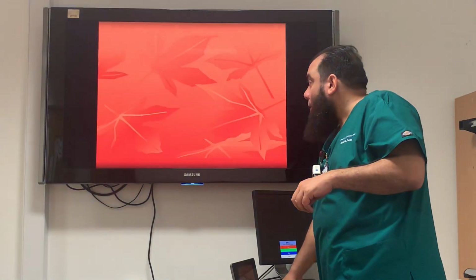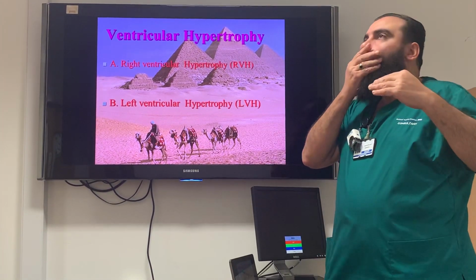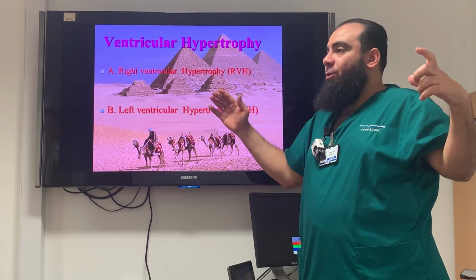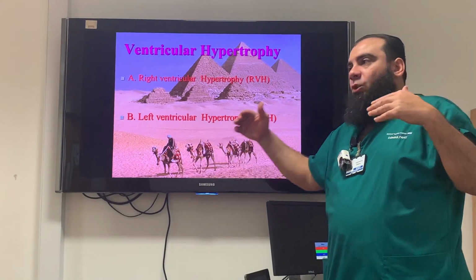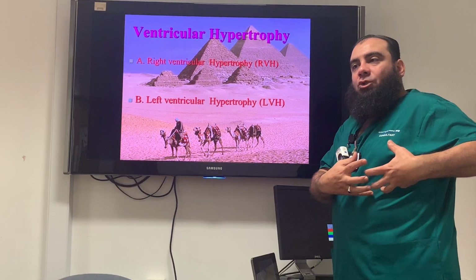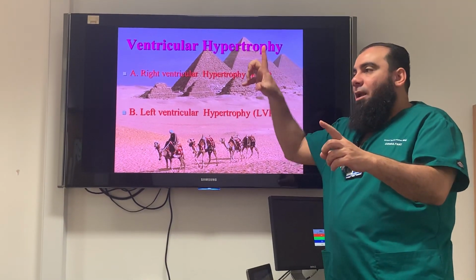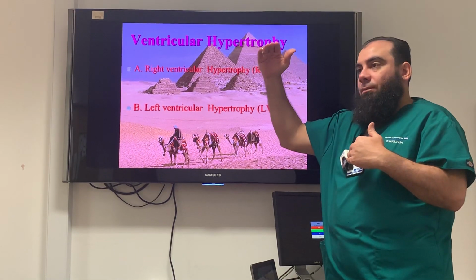So right now, sorry for that, I'm going to discuss hypertrophy. When we speak about bundle branch block changes, we speak about timing. Wide QRS complex in bundle branch block means delay, it means timing, that's why broad QRS. But if we speak about hypertrophy, it means big chambers and is going to give a strong impulse, which will be reflected as peaked or high amplitude complexes. We speak about voltage and amplitude. Okay?